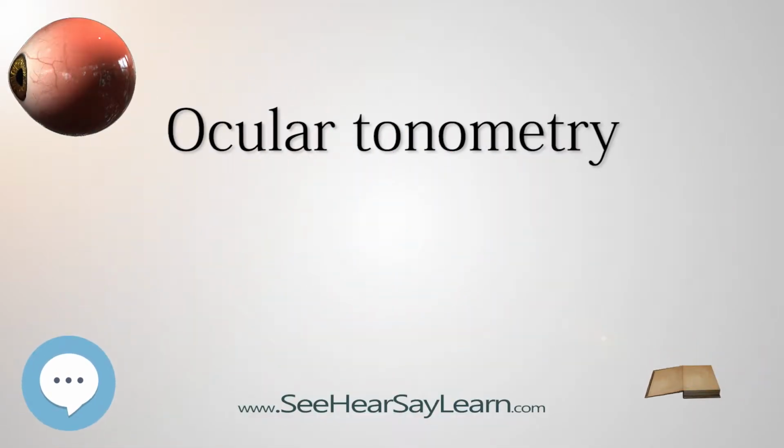Tonometry is the procedure eye care professionals perform to determine the intraocular pressure, IOP, the fluid pressure inside the eye. It is an important test in the evaluation of patients at risk from glaucoma. Most tonometers are calibrated to measure pressure in millimeters of mercury, mmHg.